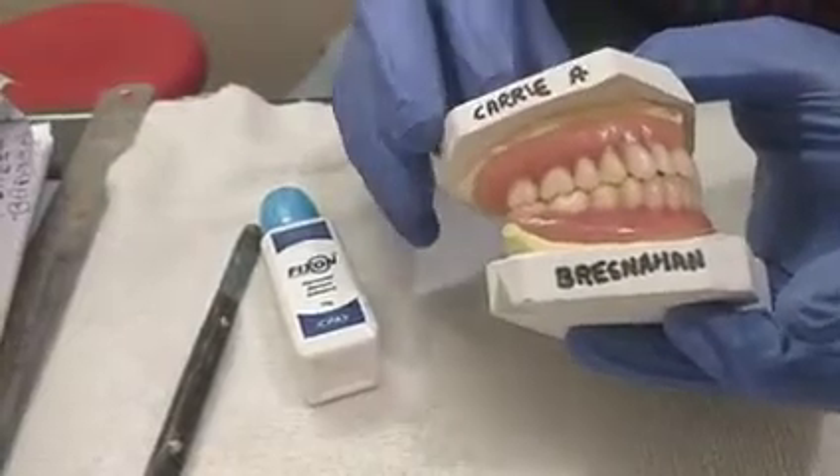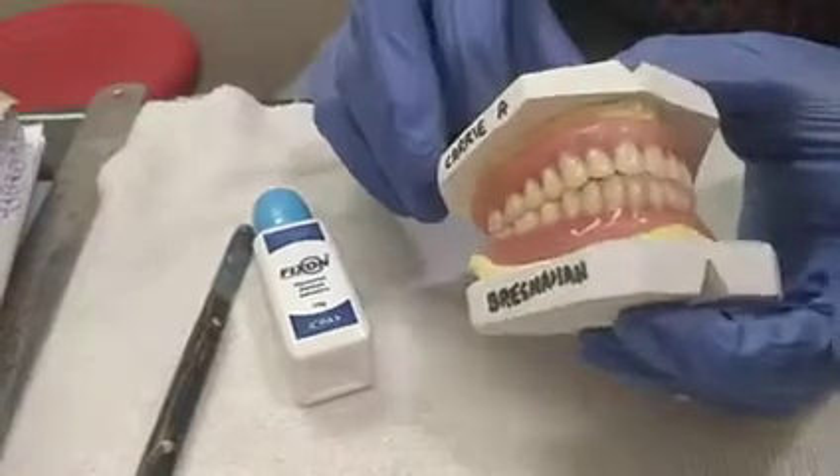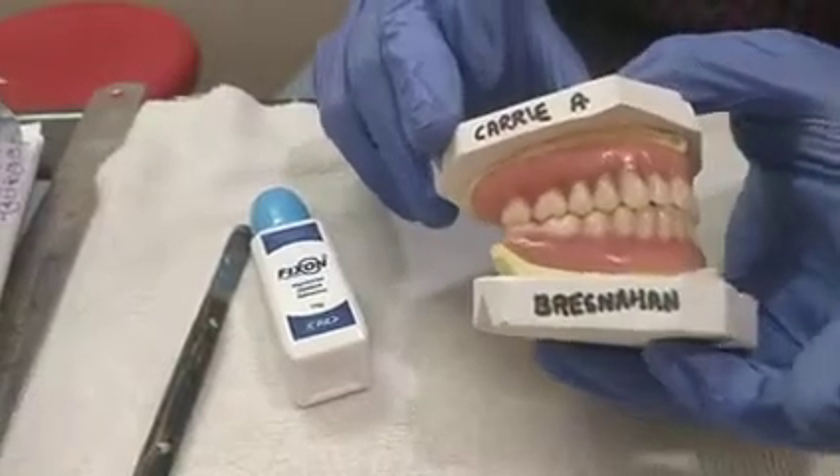You can check the molar relationship on both the sides and the anterior overjet and overbite. Hope you have enjoyed this video. Have a good day, bye bye.